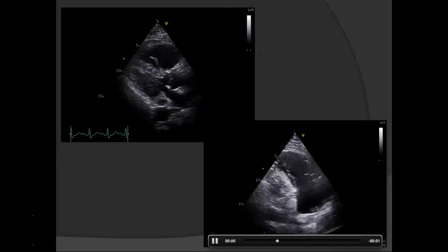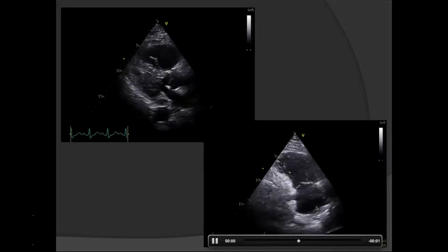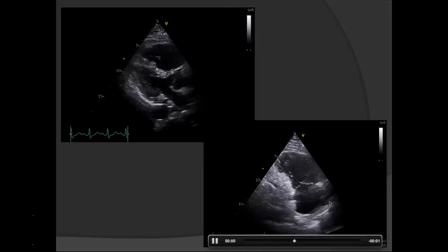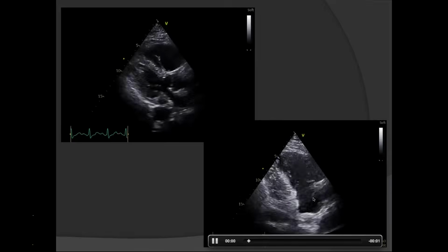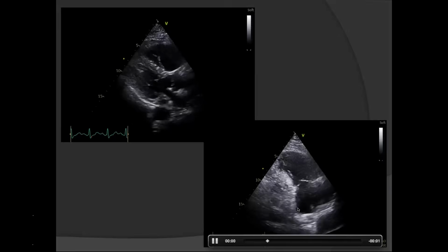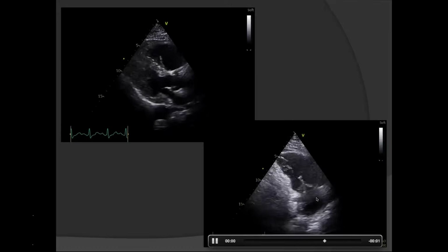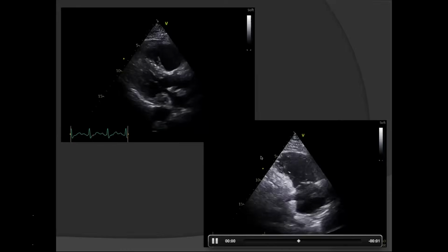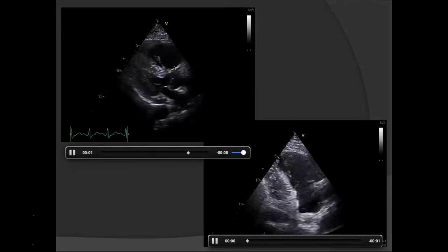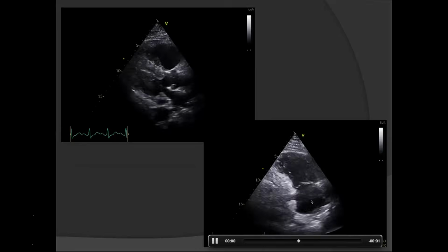So we have caught the scenario in the previous case. We had seen a pulmonary embolism which had already happened. Here we are seeing a pulmonary embolism happening live. So this is a thrombus cast in the form of deep vein leg veins, a long elongated thrombus cast of the deep veins traveling from RA to RV. Part of it has already traveled to pulmonary circulation, causing pulmonary embolism. That is why the patient has RV dilatation already, but it is still in transit.